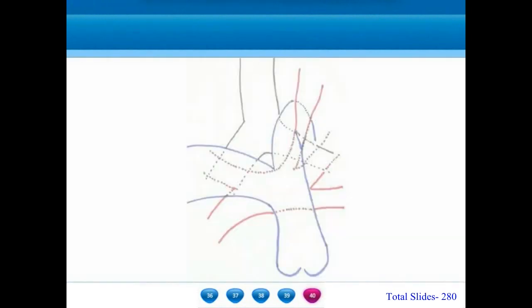On a cartoon example, the left vertical vein that is getting obstructed is exactly located posterior to the left pulmonary artery and anterior to the left bronchus. In situations of pulmonary hypertension where the pulmonary artery distends further and further, the level of obstruction caused by this bronchopulmonary vise is going to worsen more and more, and as time passes, the bronchopulmonary vise becomes more and more clinically significant.